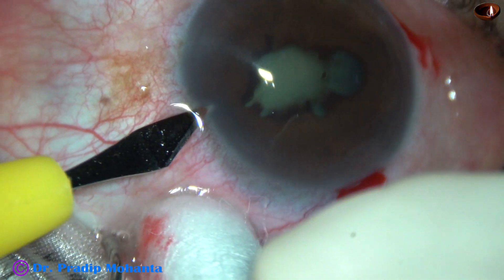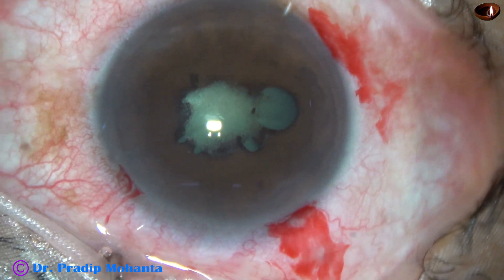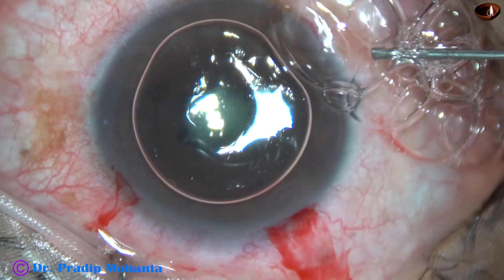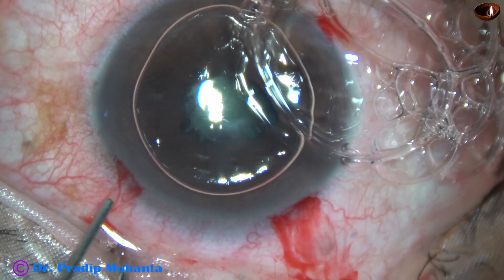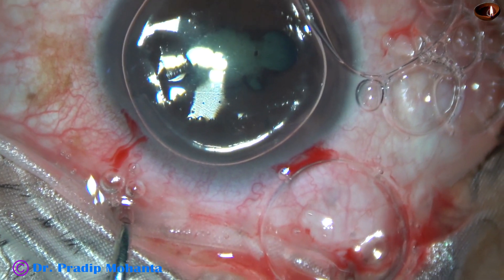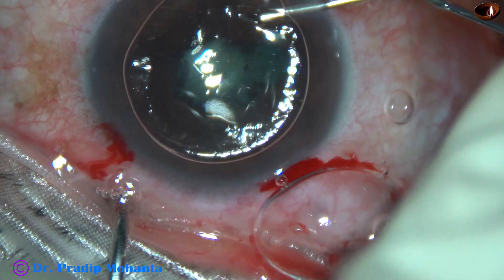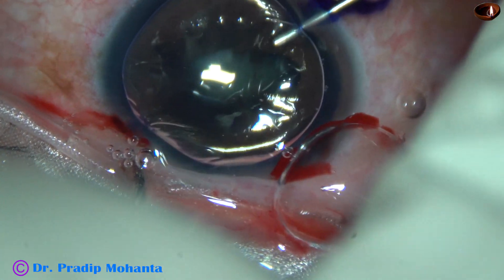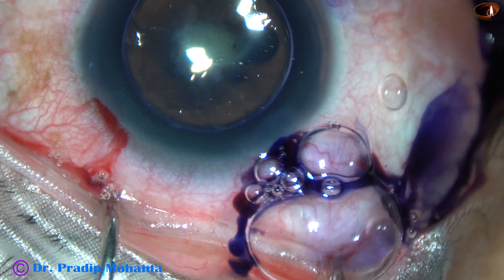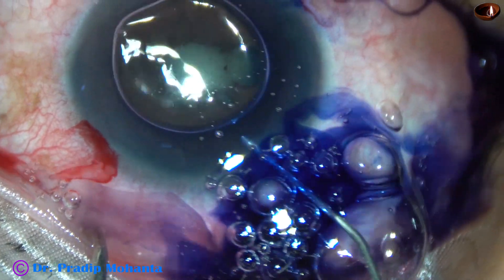By this time, the main incision and two side ports have been made. And now an air bubble is injected. My plan is to stain the anterior capsule with trypan blue dye underneath an air bubble. And here goes the dye. But since only a small part of the anterior capsule is exposed, some amount of dye is applied under the iris. This is a bit of adrenalin.